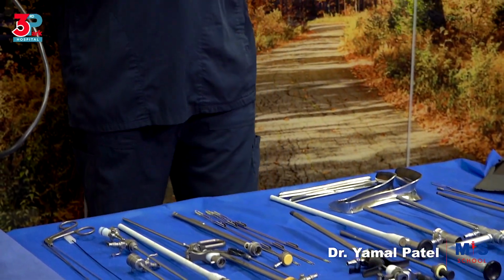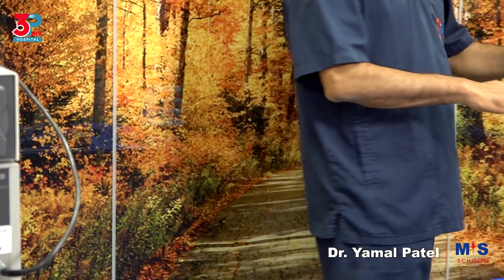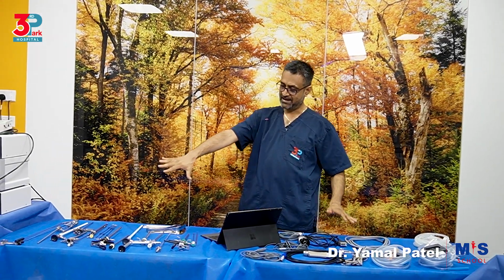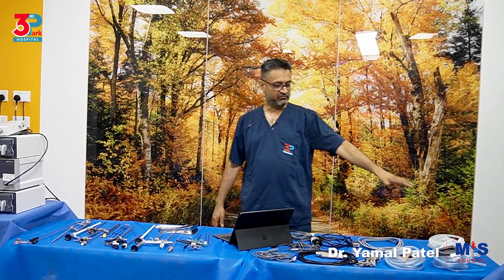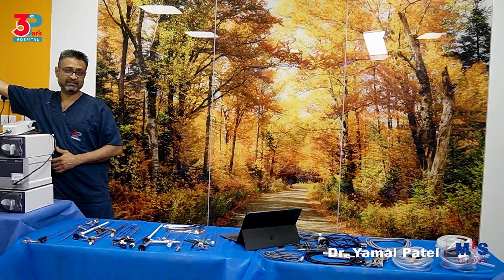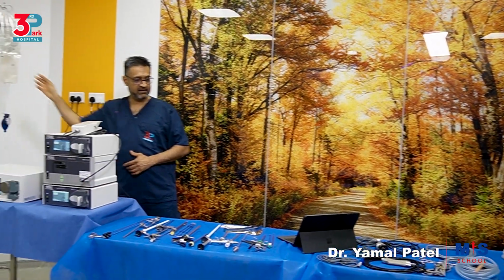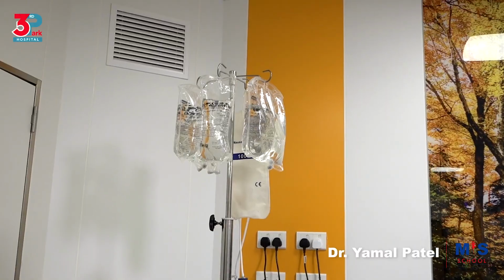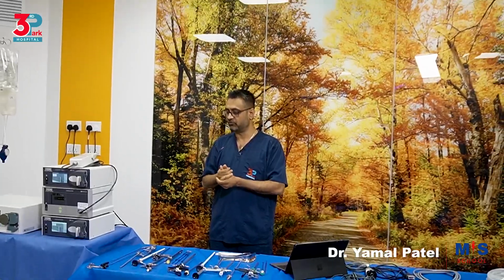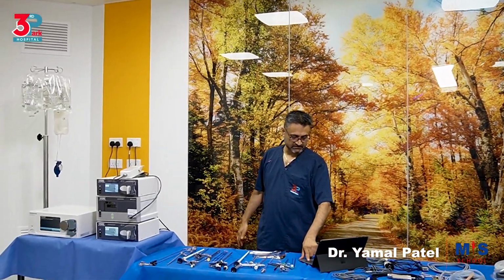In consumables, we will need hysteroscopy tubings. The cables are all part of the equipment. We will need hysteroscopy tubings. We will need normal saline, so that is the fluid, the normal saline. You may need some tubal cannulation equipment or instruments, which are consumables in this case.